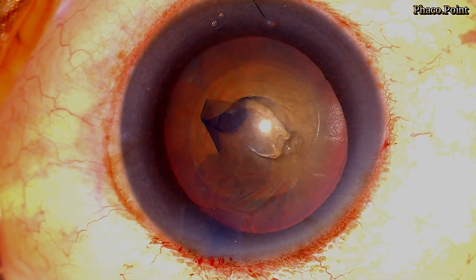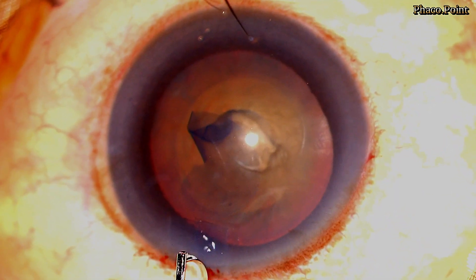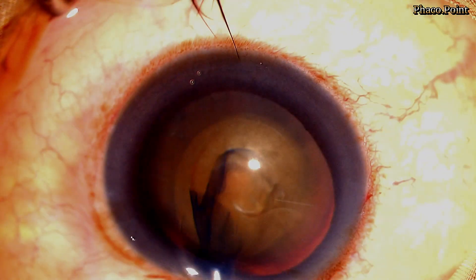Following the completion of the rhexis, some amount of viscoelastic is removed from the anterior chamber by pressing the posterior lip of the main incision. This decompression of the anterior chamber is an extremely important step. When injecting fluid to go across the nucleus during hydrodelineation, we need space for the fluid to come out from the other side. Decompressing the anterior chamber offers adequate space and negates any excessive pressure onto the posterior capsule, which could result in a blowout.